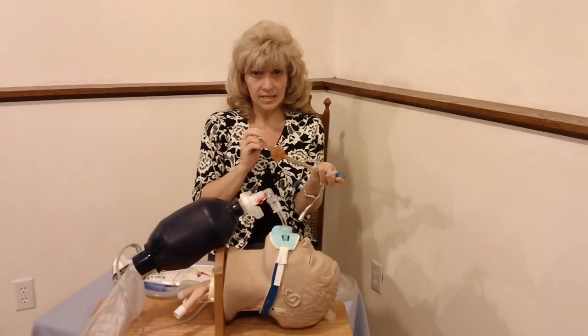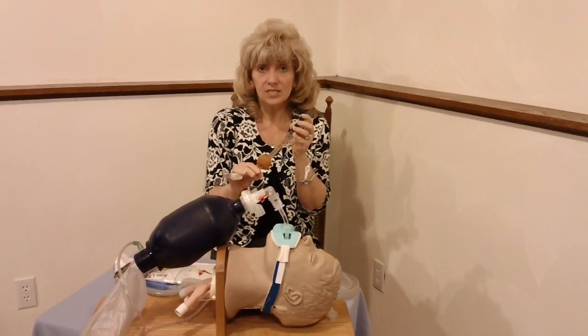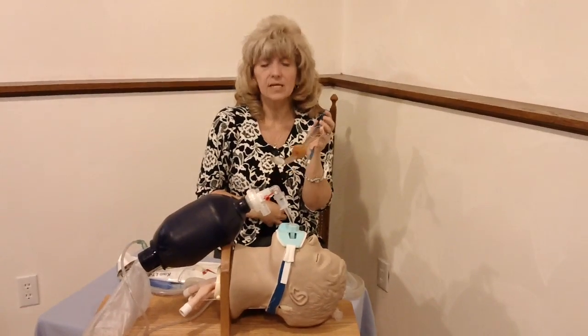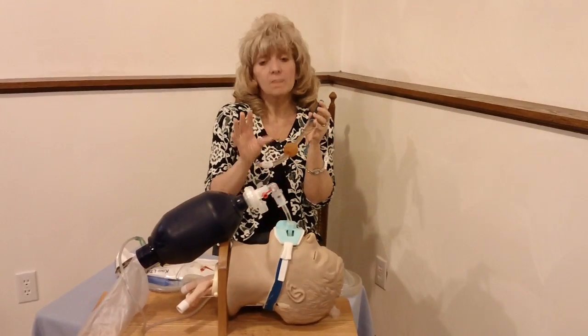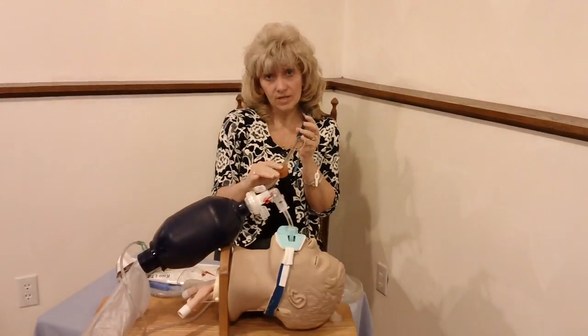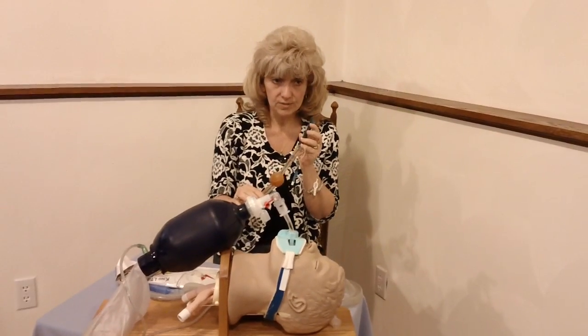Insertion is done blindly, and you need to make sure that if this is inflated, that you are listening to breath sounds, right, left, and over the epigastrium. If you do not hear breath sounds, then you need to pull the tube back after you deflate the bulbs, and then insert it again, and then re-inflate the bulbs. And if you don't hear breath sounds, then you need to pull the tube out.